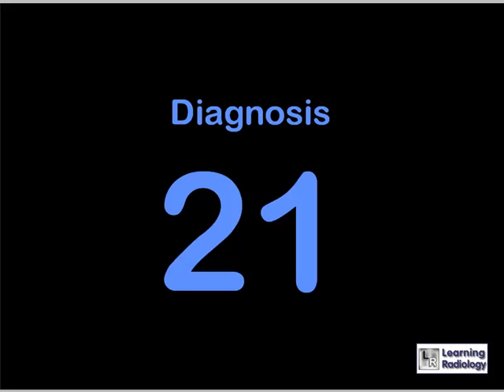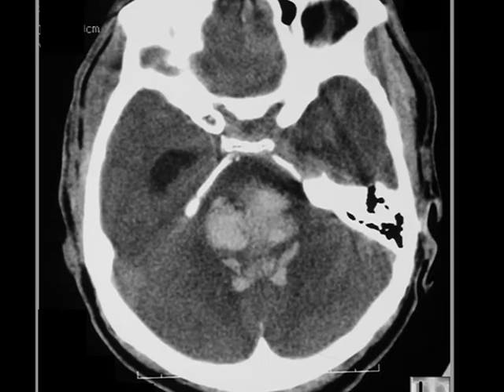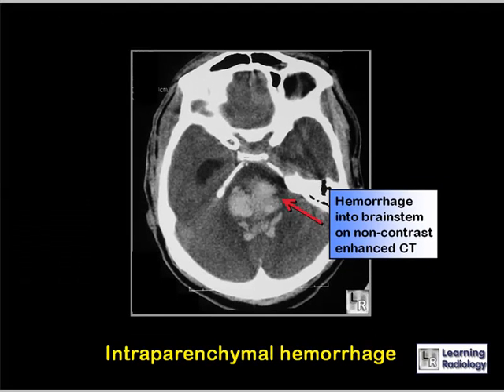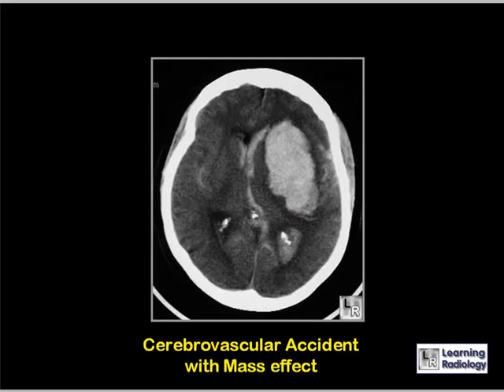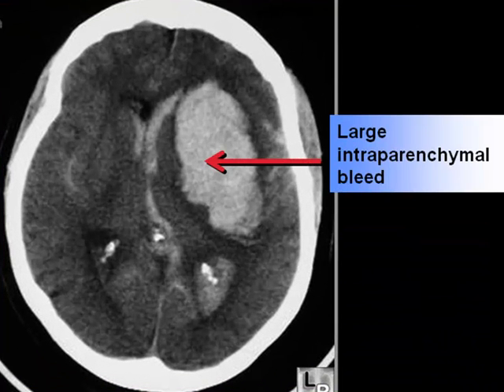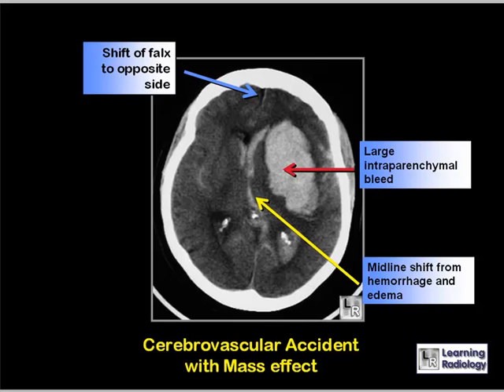Why does this 72-year-old have slurred speech? There is a large hemorrhage into the brainstem seen on non-contrast enhanced CT — this is an intraparenchymal hemorrhage. In another example, the red arrow points to the large intraparenchymal bleed, the yellow arrow to the midline shift from the combination of hemorrhage and edema, and the blue arrow to the shift of the falx to the opposite side.